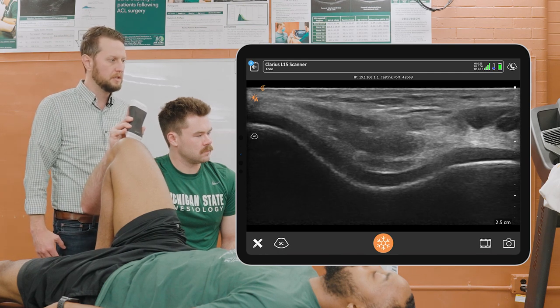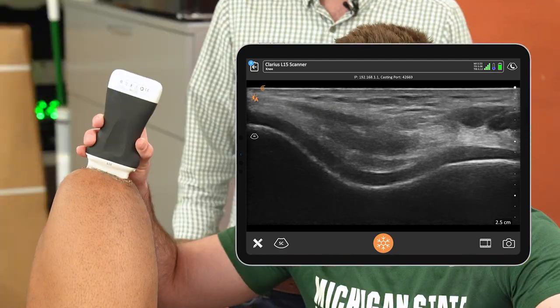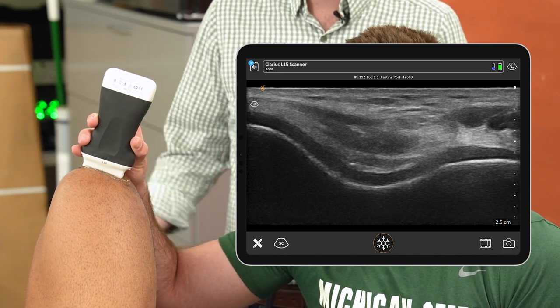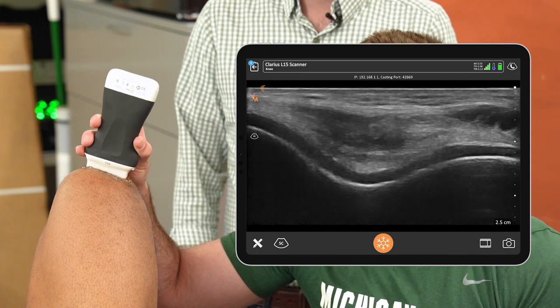Once we find that position, we'll freeze that image, and then we can use that image to gather a measure of cartilage thickness and cartilage echo intensity or brightness as a measure of cartilage composition within the knee.